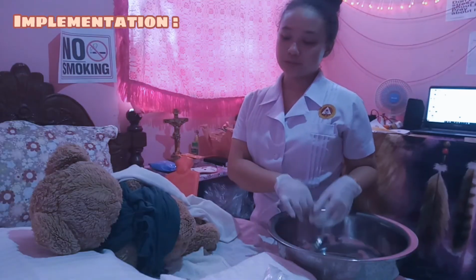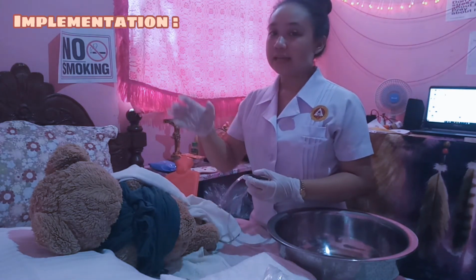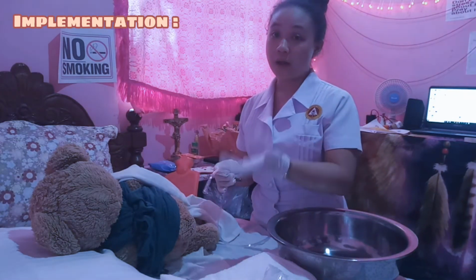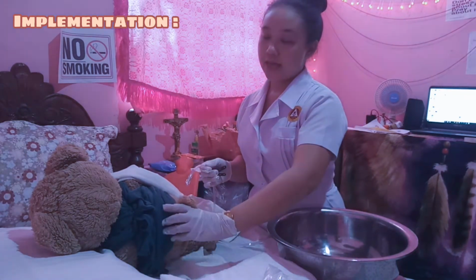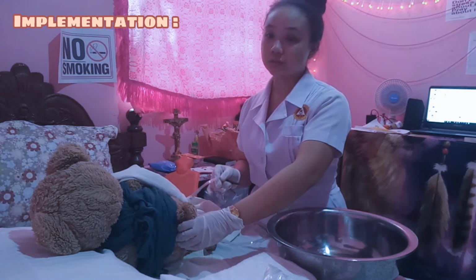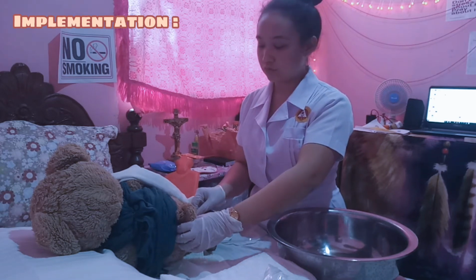And now we are going to insert the enema tube. For the client in a left lateral position, you need to lift the upper buttock and then insert the tube smoothly and slowly into the rectum, directing it toward the umbilicus.